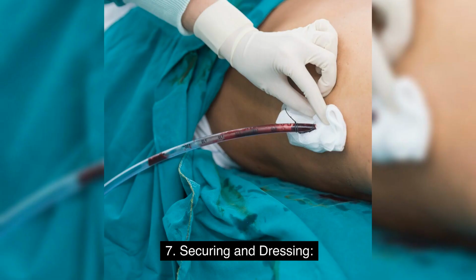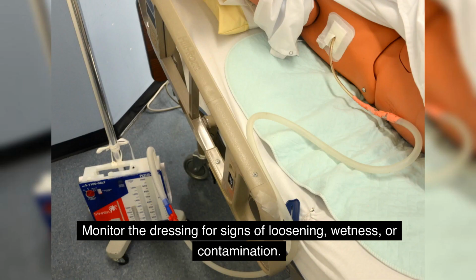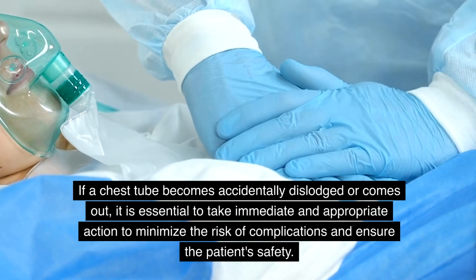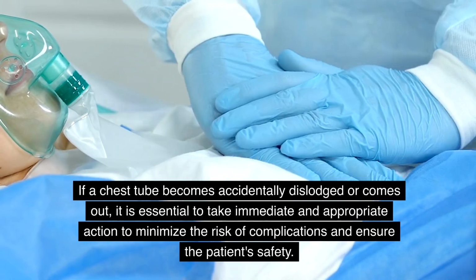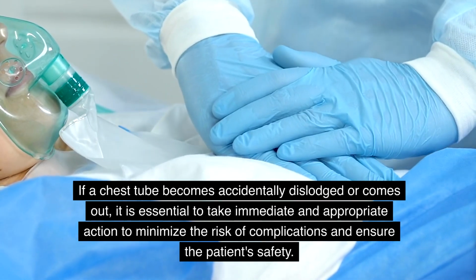7. Securing and dressing. Keep the chest tube securely anchored and well dressed to prevent dislodgement or tension on the tube. Monitor the dressing for signs of loosening, wetness, or contamination. What to do if the chest tube comes out? If a chest tube becomes accidentally dislodged or comes out, it is essential to take immediate and appropriate action to minimize the risk of complications and ensure the patient's safety.